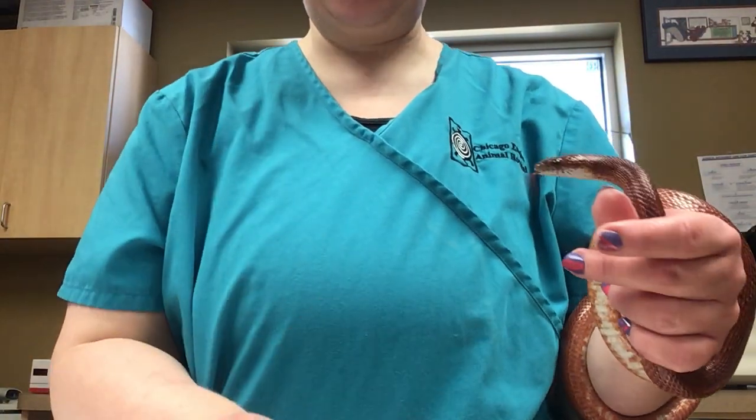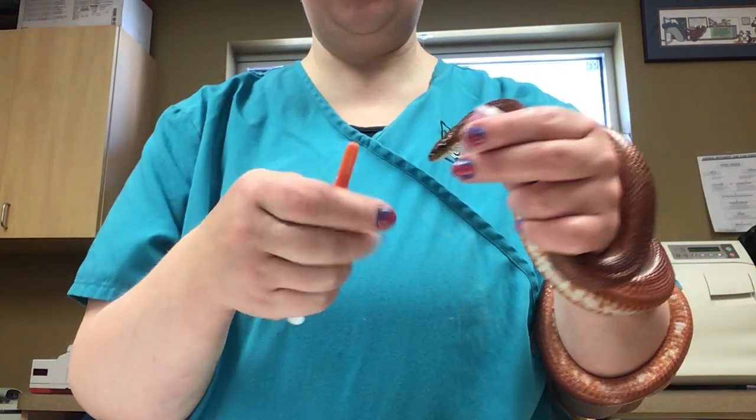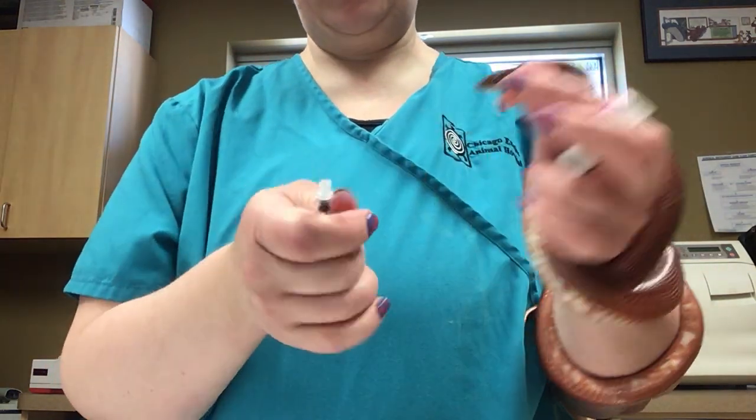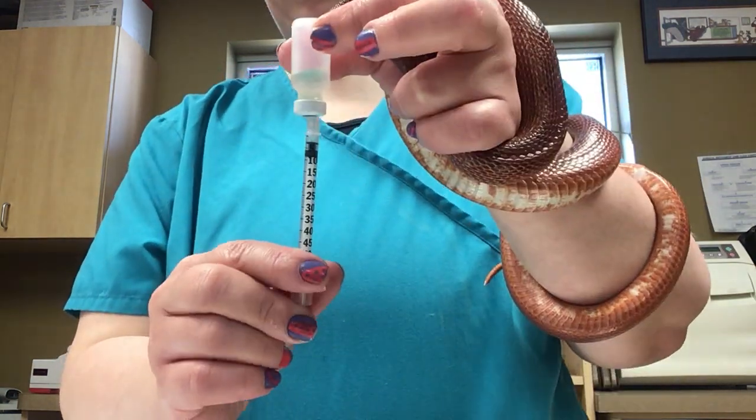We're going to show you how to give your snake an injection. You've got your little vial of medication here and you've got fresh new syringes for each injection. So you're going to take off the cap and put the needle into the center there, and draw back.